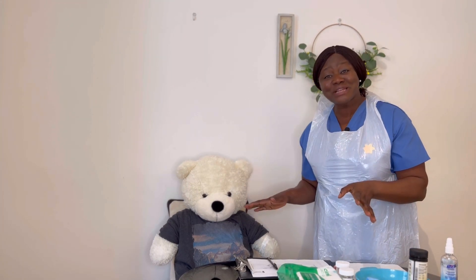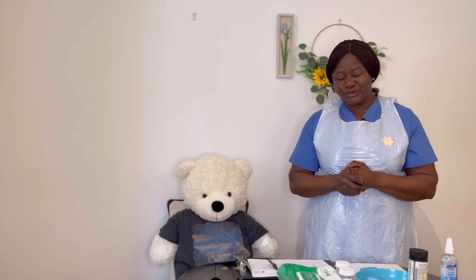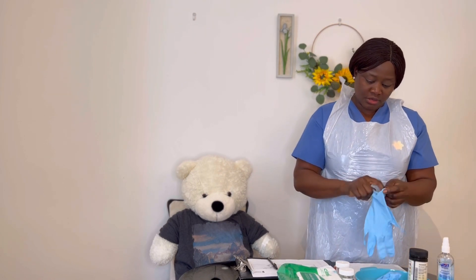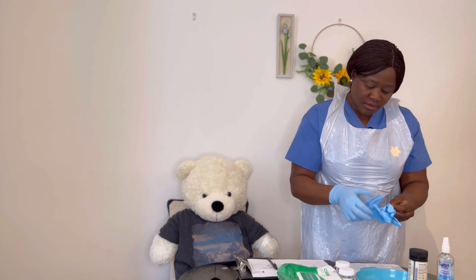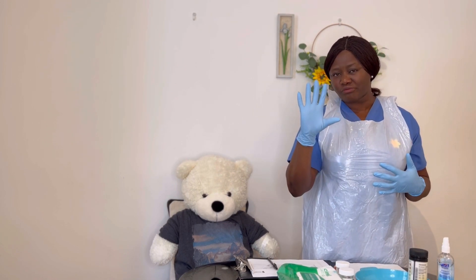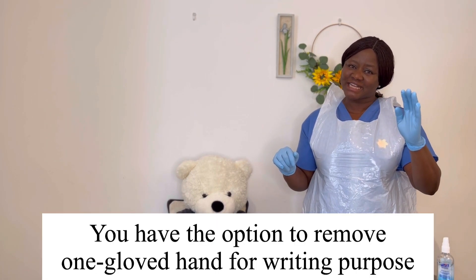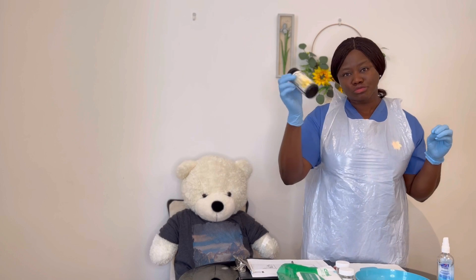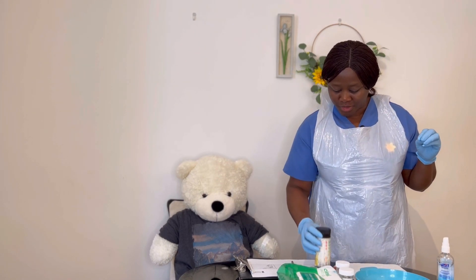Wonderful. As soon as you finish explaining that, the urine sample will be waiting. One important thing to be mindful of in midstream urine analysis: never handle a urine specimen with your bare hand. Now I will go ahead to get the test done. I'll quickly do my hand hygiene and put on my glove. I will declare this as my clean hand — I don't want to remove the glove during the process — and I will make my non-dominant hand my dirty hand, so I can use the clean hand for writing and to maneuver the multi-stix reagent bottle.